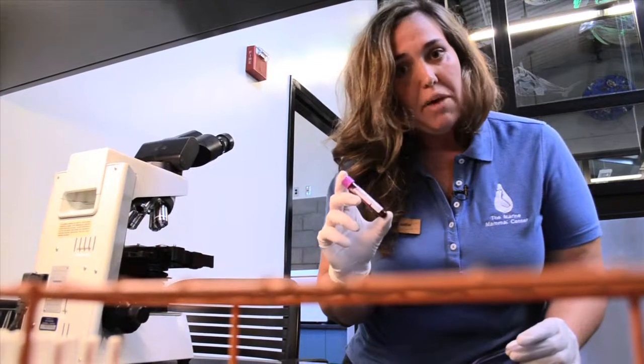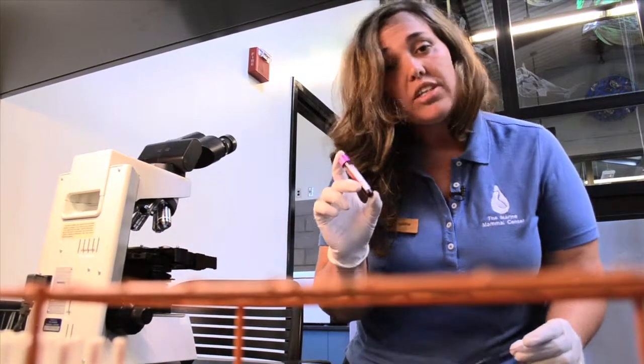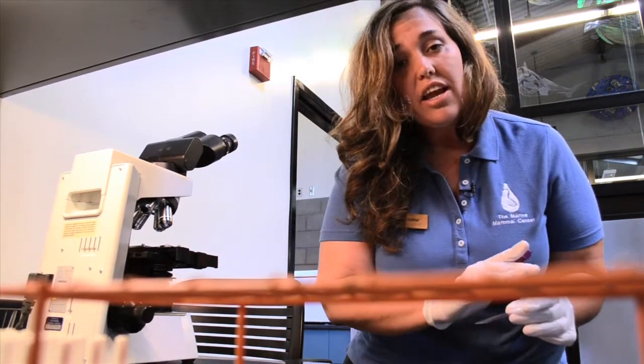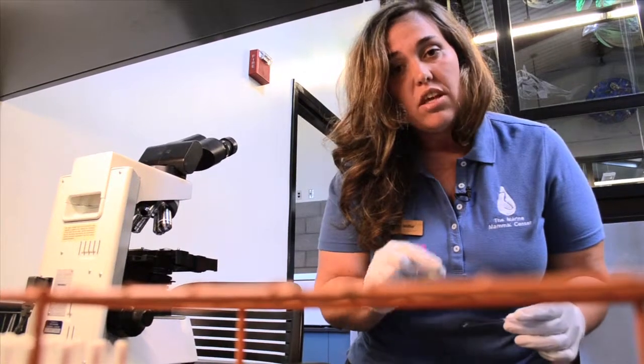After we get the results back from the complete blood count, we're going to take a closer look at this blood sample. The way that we're going to do that is we're going to take a drop of blood on this slide and create a nice thin layer across it so that we can look at each of the cells more closely.